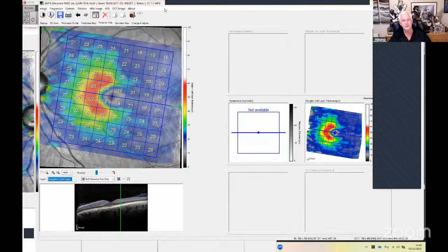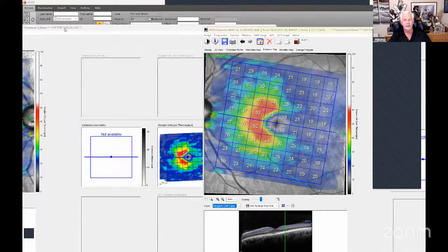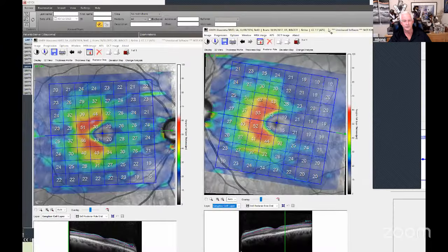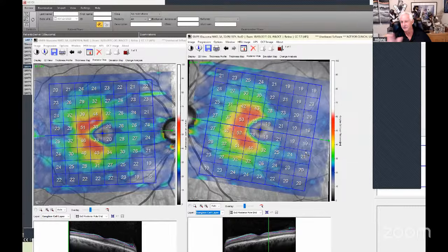And of course, what you can see there is we've got a pair of vertical hemimacular ganglion cell losses, and it's left-sided. So just by looking at those patterns, you would recognize immediately that that has got to be a post-chiasmic problem, either a left optic tract or left optic radiations problem, not something that you would associate with glaucoma.